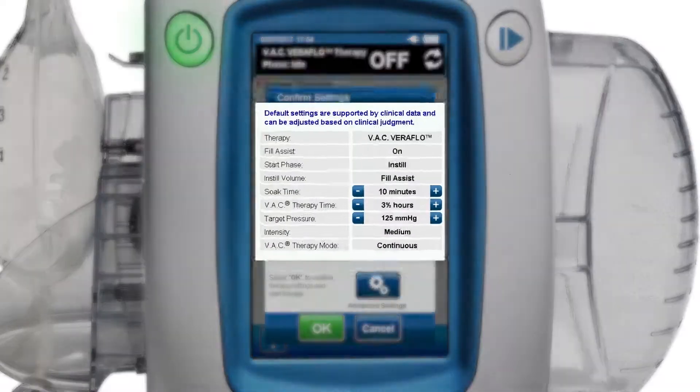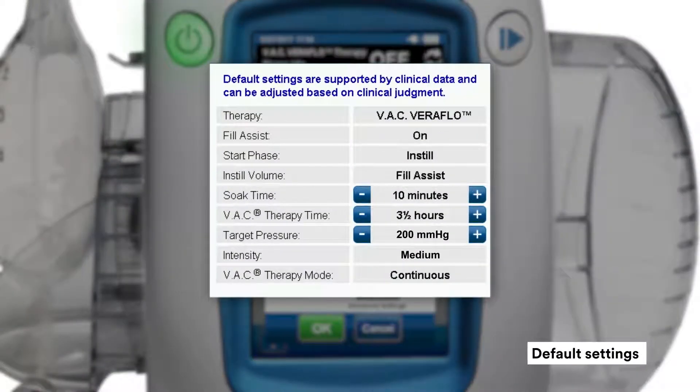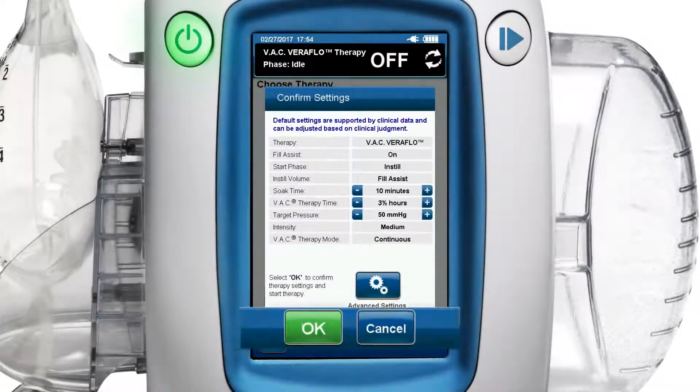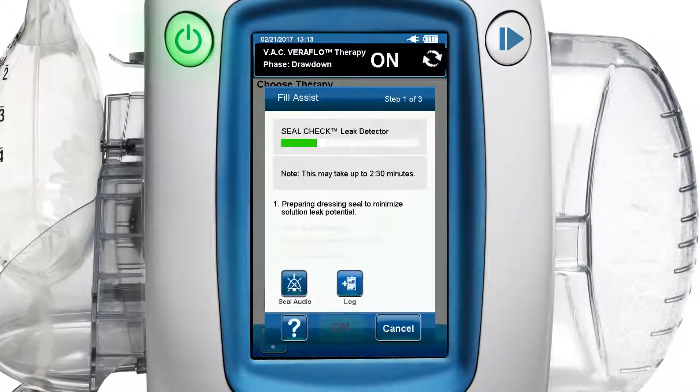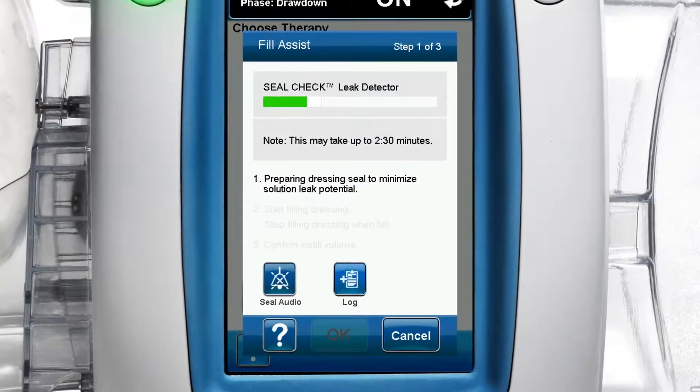You can adjust the variables on the confirm settings screen using the plus or minus signs. Next, press the green OK button to accept settings and begin Veriflow therapy. Now, step 1 of 3 of the fill assist screen appears, drawing down the dressing to prepare the dressing seal to minimize solution leak potential.